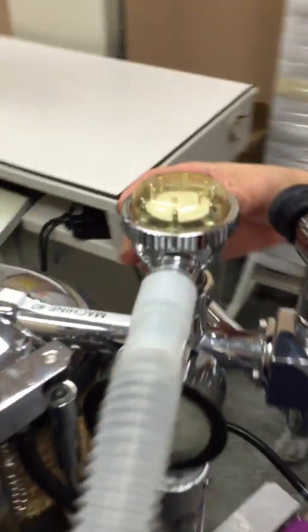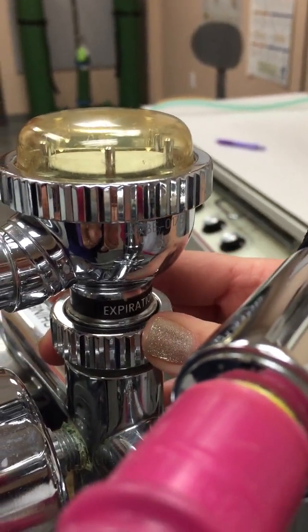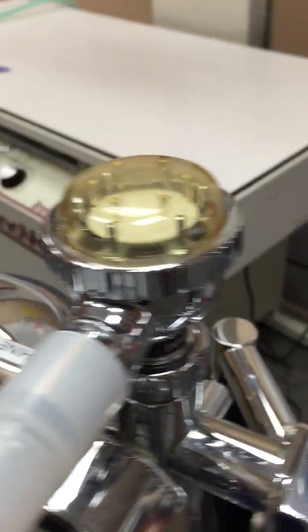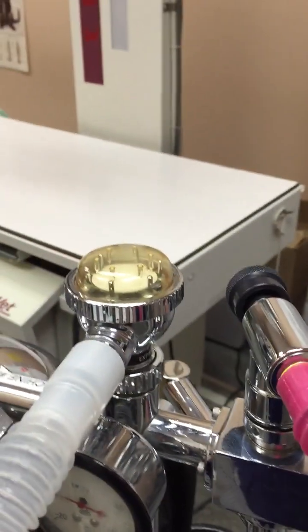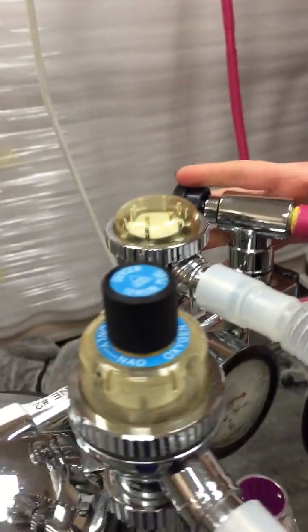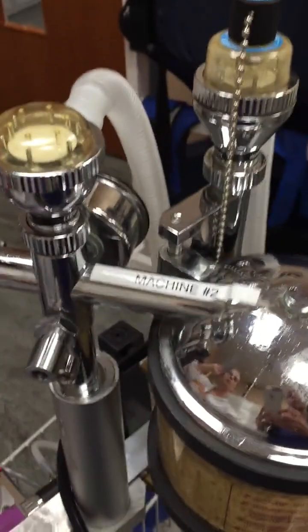When they exhale, it will take the path of least resistance and it will go through this limb now to our other unidirectional valve, and it's our expiration unidirectional valve or flutter valve, and as the patient exhales, it will lift just like this with each exhaled breath. From there are a few ways that the exhaled gases can go. So we have 3 different options.